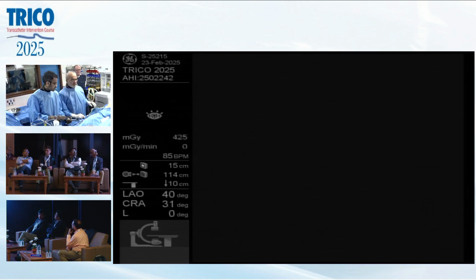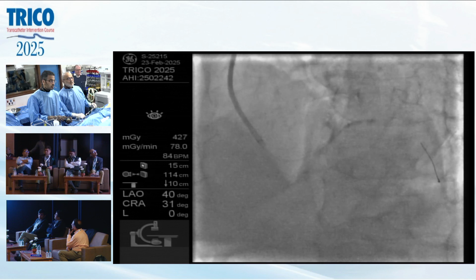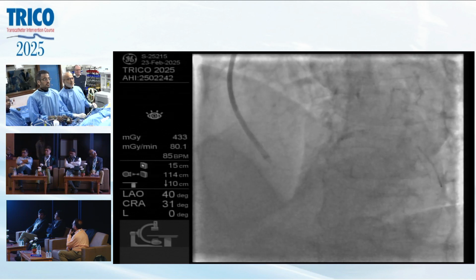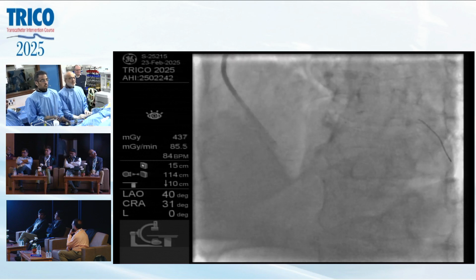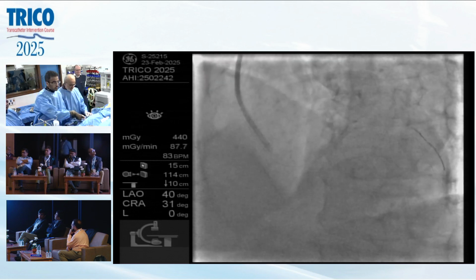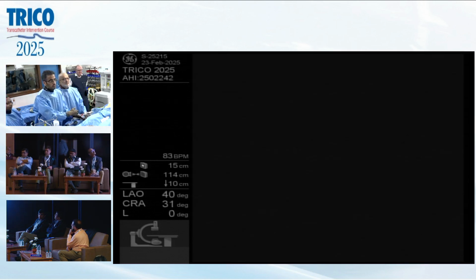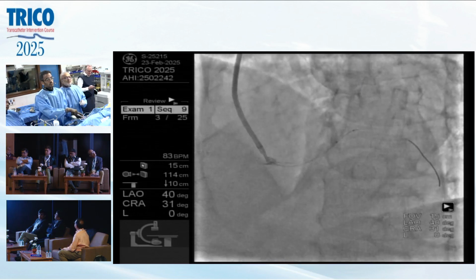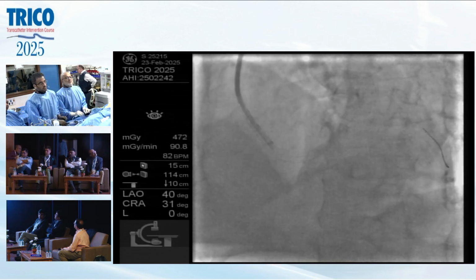Wait. Pull the balloon. Okay, deflate. Just inject and see. Okay, it remains the same. There is a lesion there again. Going further. Okay, go here.